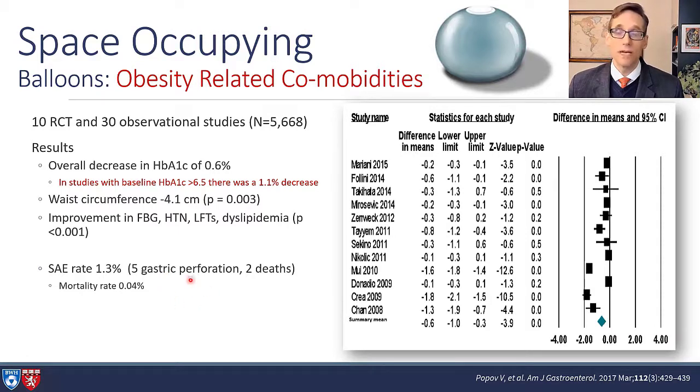Again, gastric perforation is a concern, with 5 gastric perforations and 2 deaths, primarily in patients that had prior gastric surgery. So again, that is a contraindication.